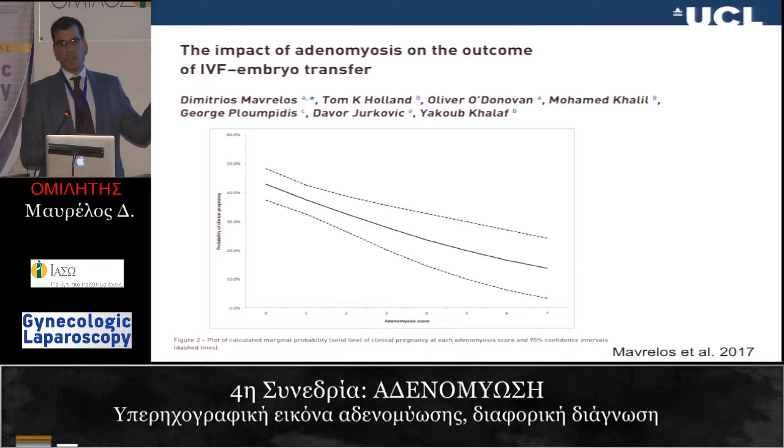So there you go. This is how you diagnose adenomyosis, and this is how you then say this adenomyosis is okay, it's not that bad, or it's really, really bad. And there's correlation between what you see on scan and what the patient actually experiences. What are the differential diagnoses for adenomyosis?